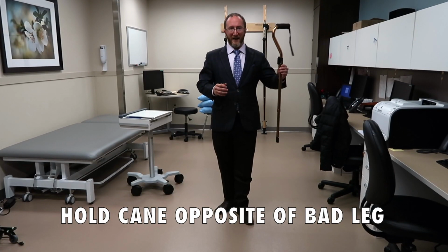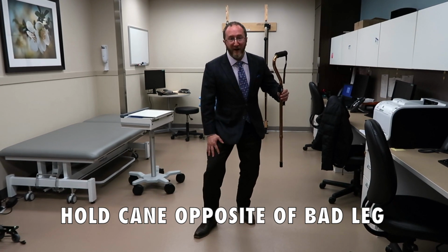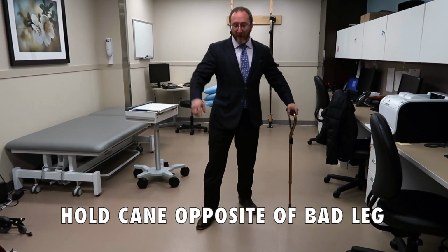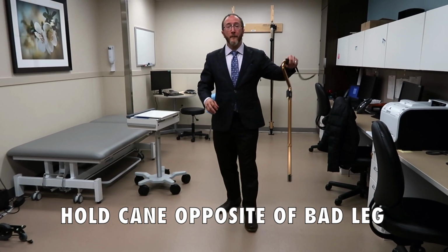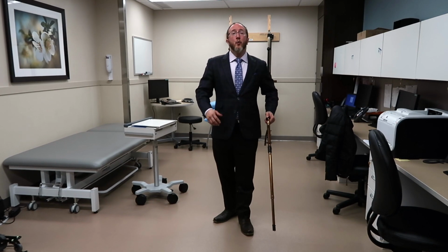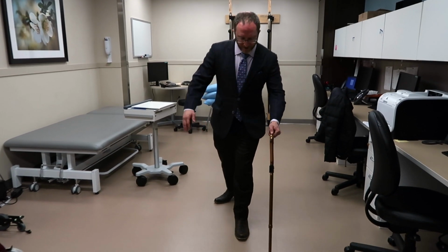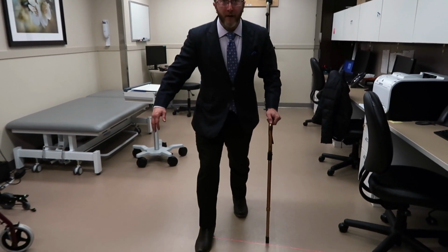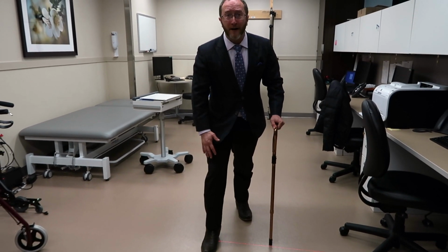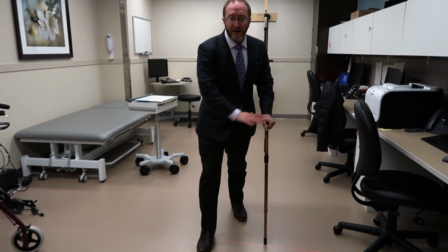So when you're using a cane for a weak leg, you're going to hold the cane on the opposite side of the weak leg. So if my right leg is weak, I'm holding my cane on my left, not on my right. That's the first thing. And you want to use the cane along with your leg. So I take a step with my left foot, and then I plant my cane and I use my right foot. What this is doing is it's taking the pressure off my right leg and transferring some of it here.